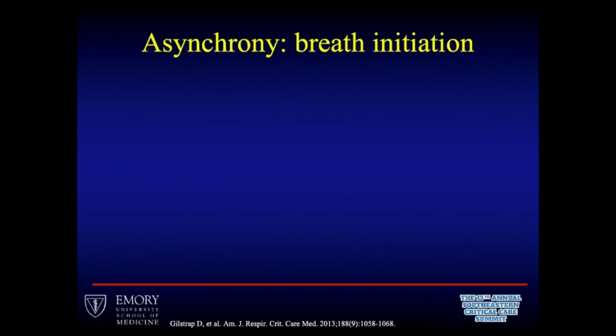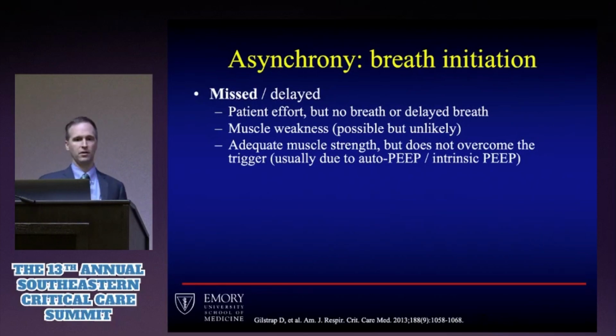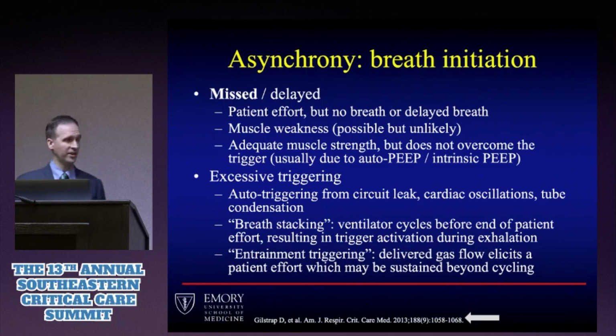So I'm going to go by the ventilator breath phase. So ventilator breath initiation or triggering. Most commonly this is a missed trigger. And just for time, I'm going to pass on why it occurs, but we'll get to that a little bit in just a minute. But it can be excessive triggering. I have examples of each.